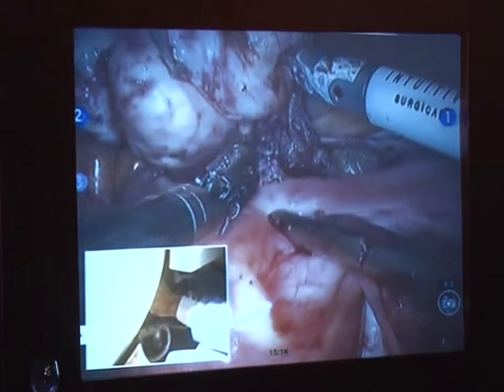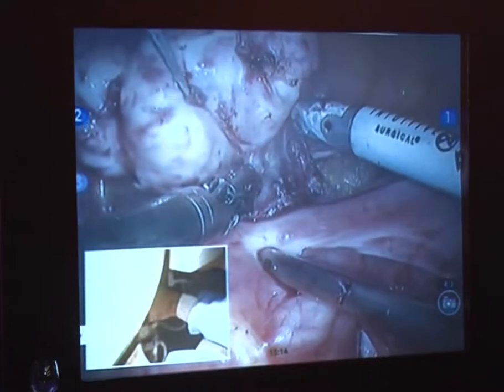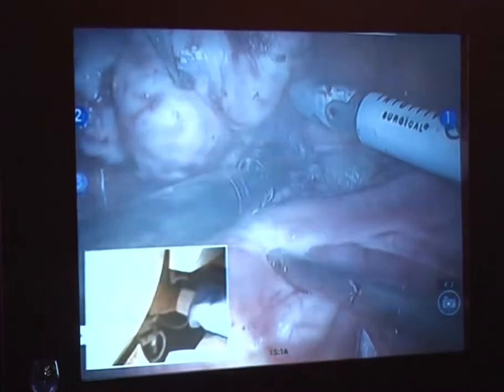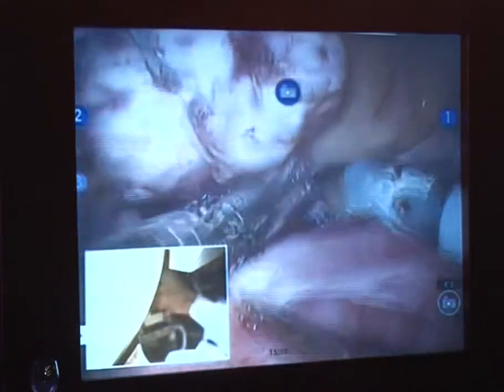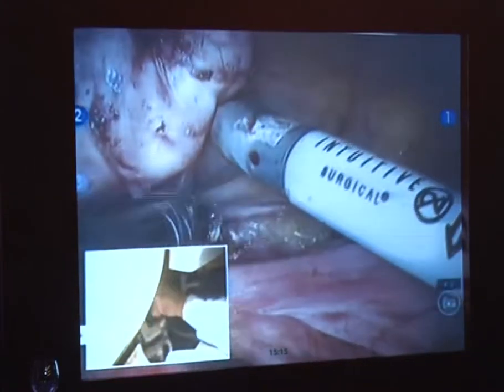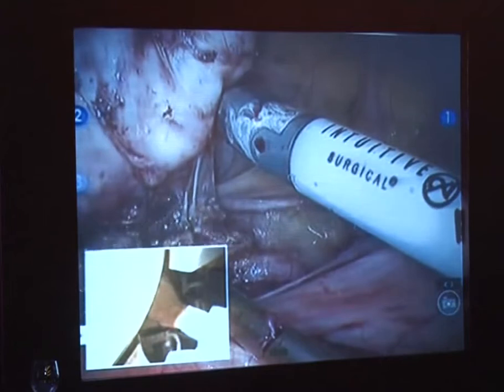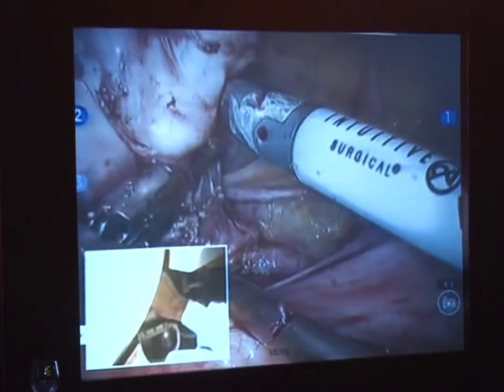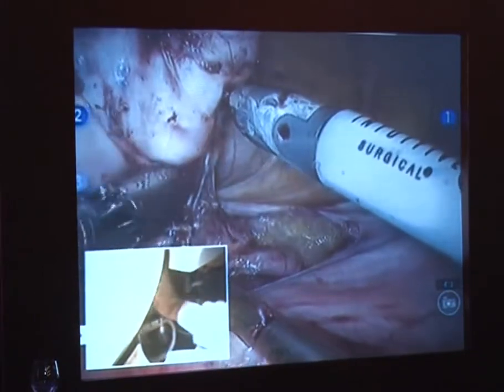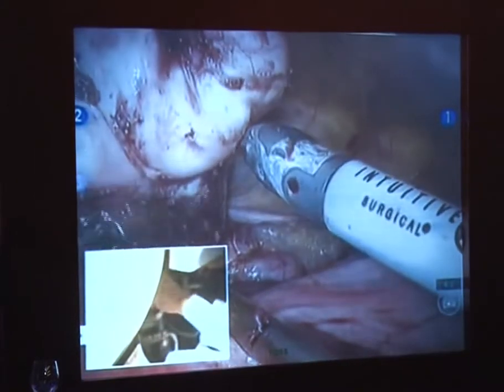Arnie, I watched Michael Pitter do one just like this. And he went posteriorly and opened up and transected the uterine as well. Would that ever be something you'd consider doing? If I couldn't approach it anteriorly, I would. But it looked like it was much easier to access from an anterior location than it was posteriorly. So I typically choose the route of least resistance. And so this, for me, is the route of least resistance. So I chose this approach. As you can see, it was a good one to choose, because we were able to get the myoma out a little bit easier this way. And we have a little bit better control of it this way.